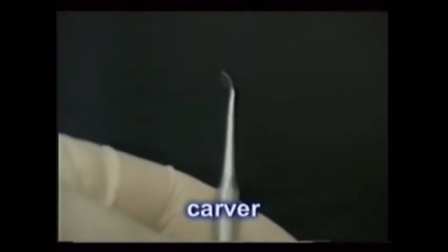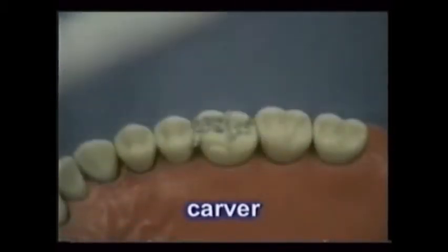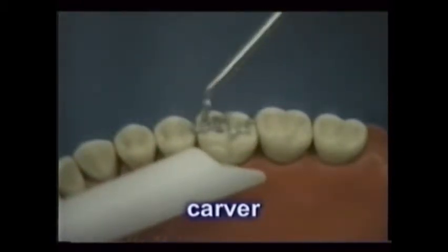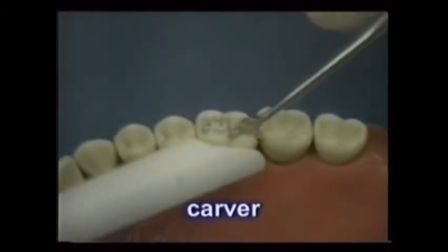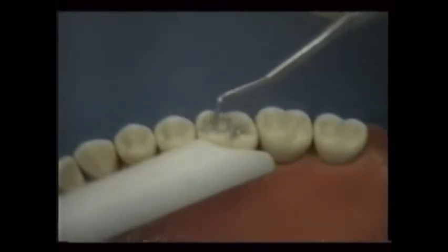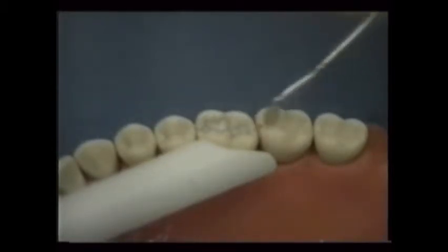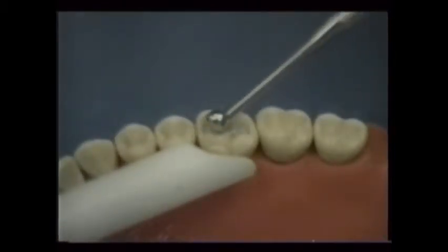Once completely filled, a carver is used to shape the filling, conforming it to the tooth surfaces before the filling sets. Burnishers are rounded instruments that smooth soft dental materials like thin layers of gold and amalgams that are not yet set, and may be used before or after carving the amalgam.